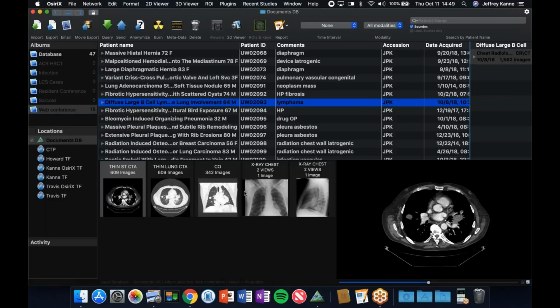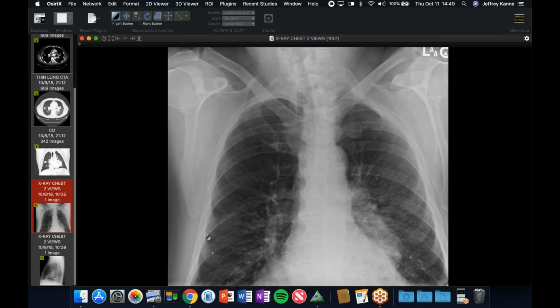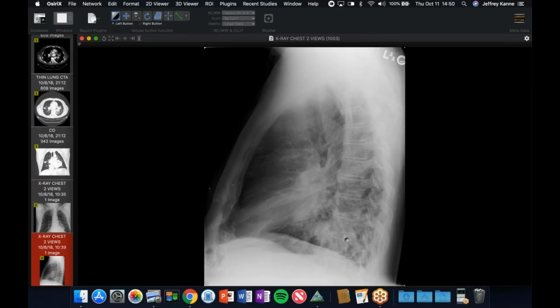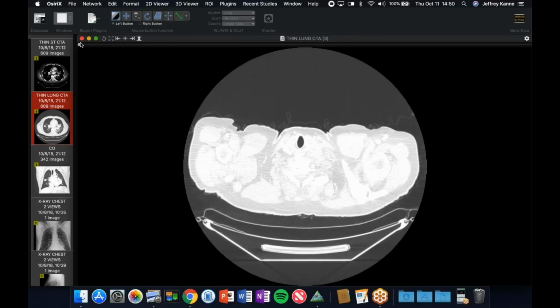This is kind of interesting. This is a guy with a history of lymphoma, diffuse large B cell. He's very tall, so he doesn't quite fit on the radiograph. But you can see he's got four of these weird densities in his lungs, following the bronchovascular bundles. This looks more mass-like, but in the lower lobes, it looks more like aspiration, maybe some consolidation. But you can clearly track it along the hilum. There's thickening posteriorly. So of course, infection, and then I'd have to think about lymphoma.